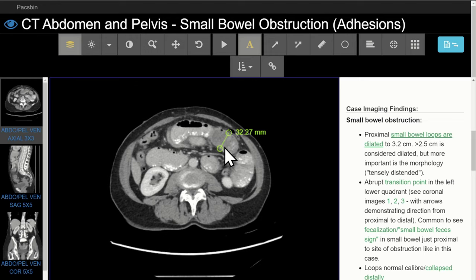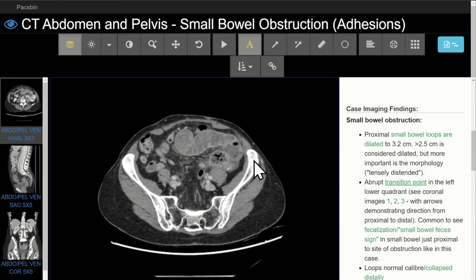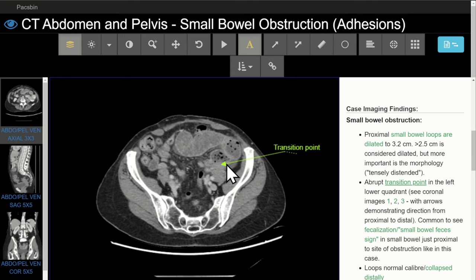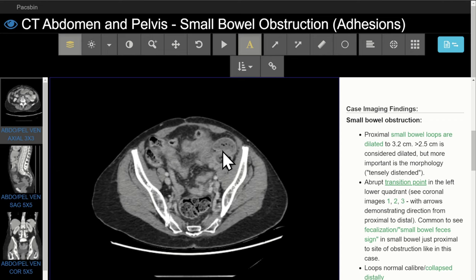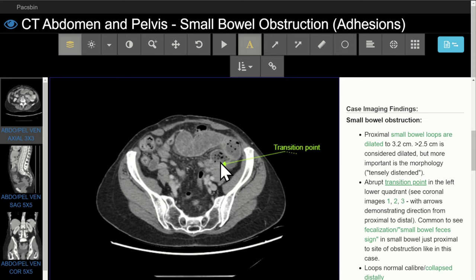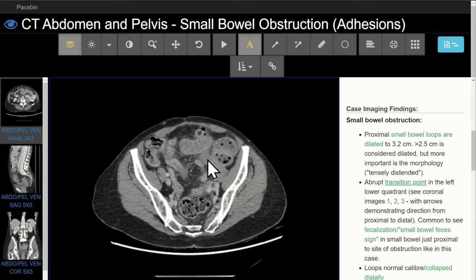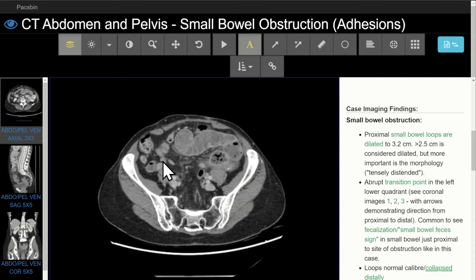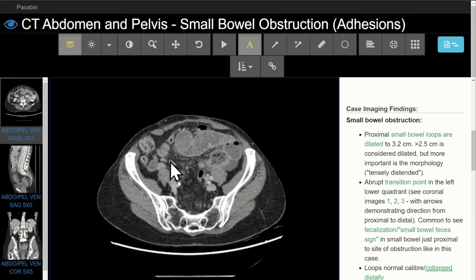Even more important than the measurement itself is the morphology of the small bowel — it looks tensely distended. If we follow the small bowel loops, we will eventually get down to an abrupt transition point. The abrupt transition point has dilated loops just proximal to it, and then collapsed or normal caliber loops distal to it. Here you can see the dilated loop with small bowel feces sign or fecalization, and then an abrupt change in caliber and direction, with the small bowel distal to the transition point being normal caliber or collapsed.